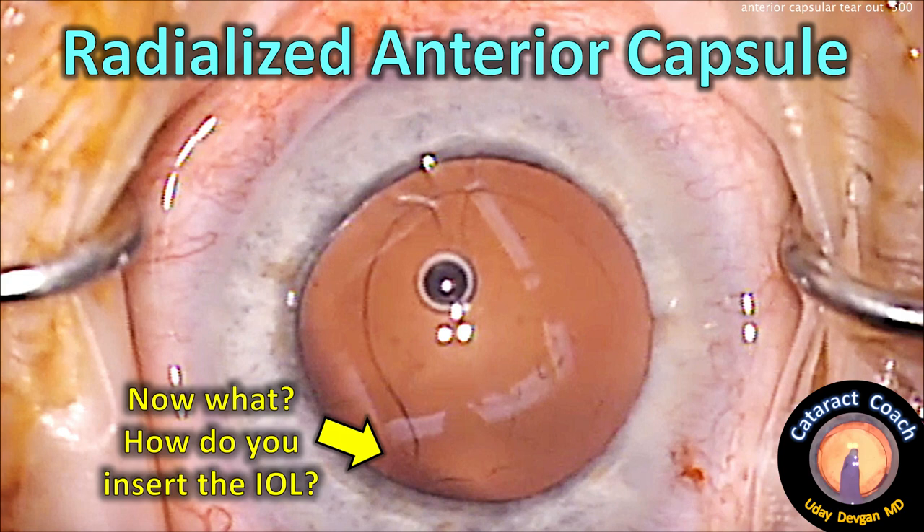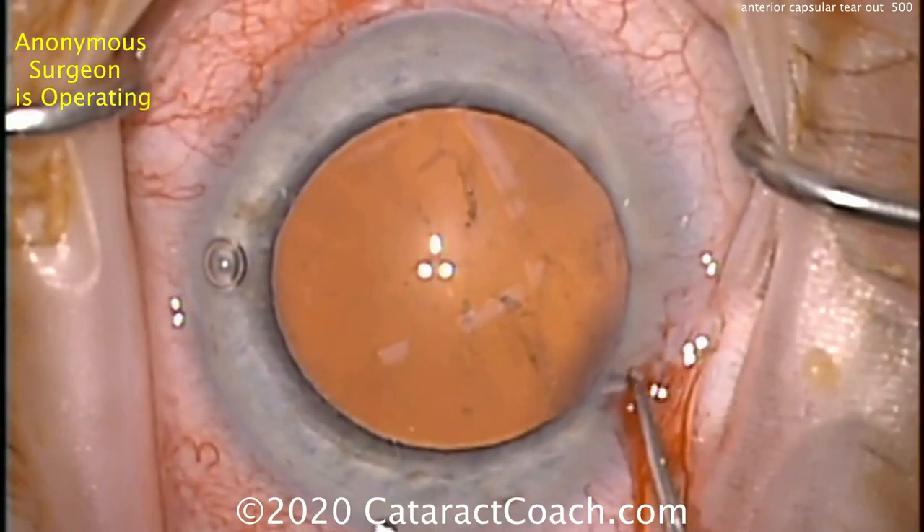Hi, REC-Coach.com. Radialized anterior capsule — now what? How do you insert the IOL here without causing more issues?